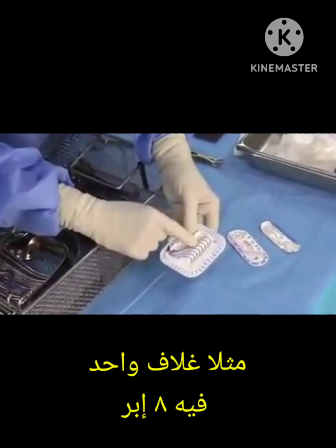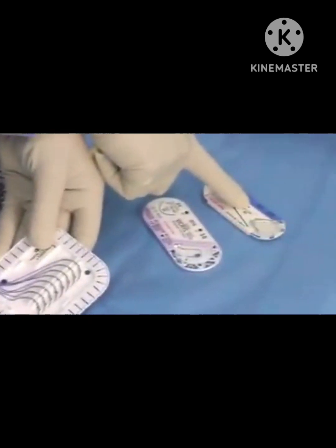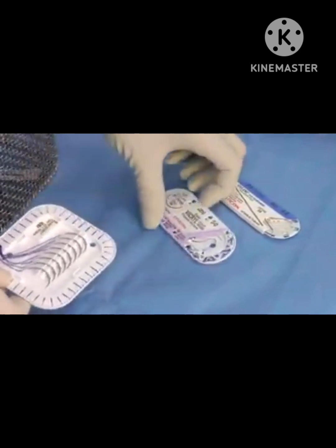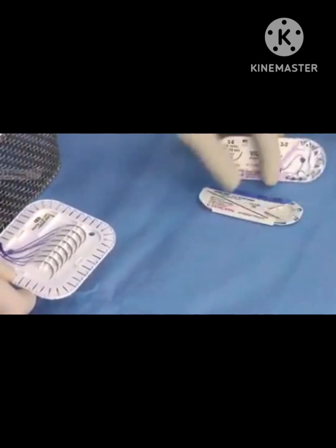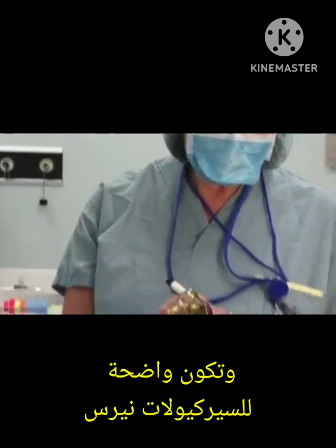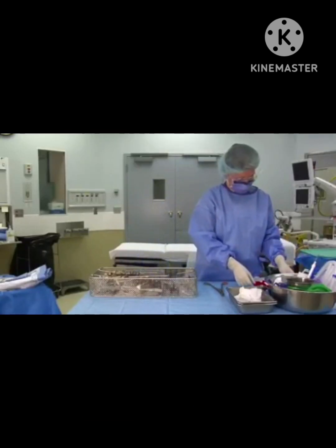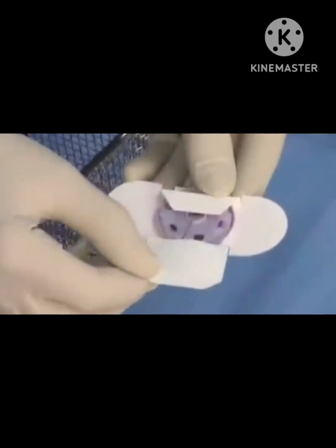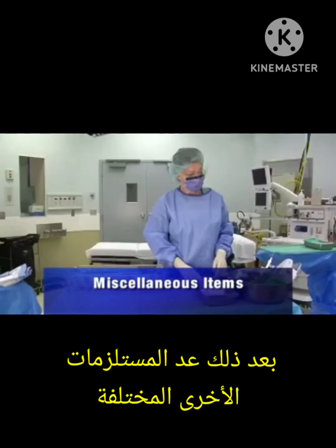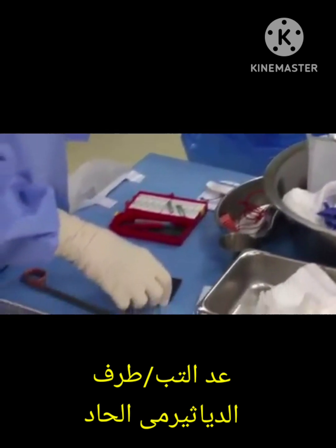Count all suture needles — multiple sutures must be clearly visible to the circulating nurse in order for the count to be accurate. Once counted, place the sutures in the area that they will be used from. The suture reel is counted next as one item.